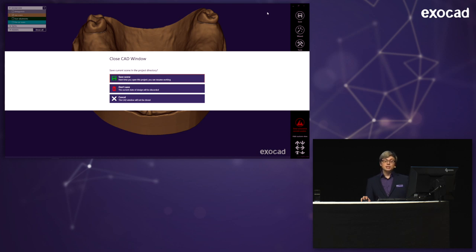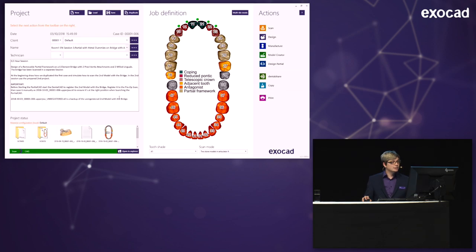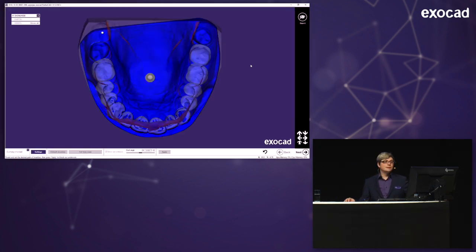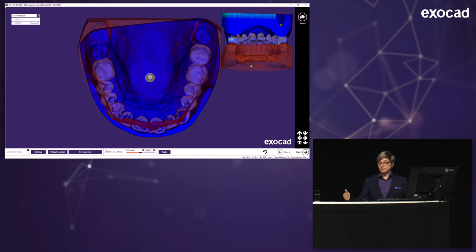And because I've matched it already in the software, I'm not going to save that, it's at the same position as well. And all the important parts will be on the right positions too. So this way, I only had to rescan one model and can still use all the old data. So I'm clicking on the partial framework. How many of you have used the partial framework software up till now? OK, not that many. You may realize it looks a bit different, but it's based on the same logic most of the time. The difference is that you have the wizard down here, and you have the expert mode up here. And you're going to see how this works now.